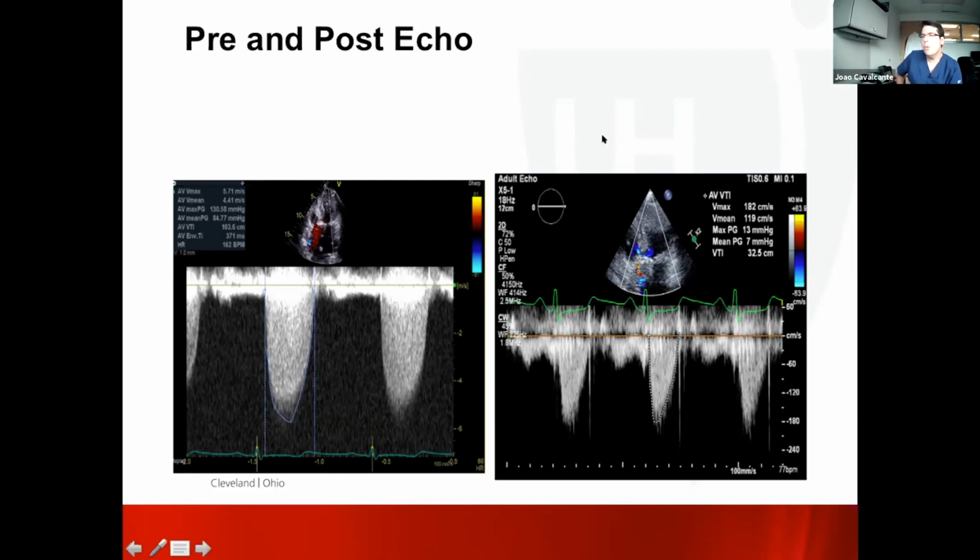And I was going to ask you a quick question here. You implant high, and that's a beautiful result here, Guy. Any concern about coronary access? Yeah, that's a good question, João. This patient, as you could see in this CT, her anatomy, I mean, she has a very, very large STJ and large sinus of Valsalva, so not really. I think this is a patient that we can get coronary access. If her anatomy was smaller, right, and in fact, I think this is a very appropriate question, João. There are some patients, some situations that I elect not to implant the valve.